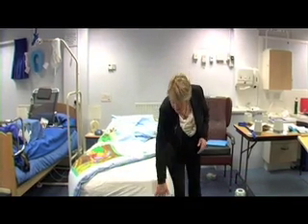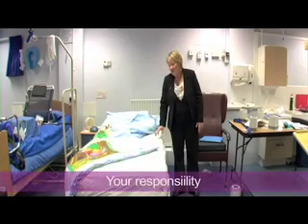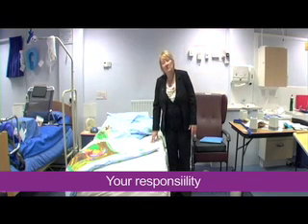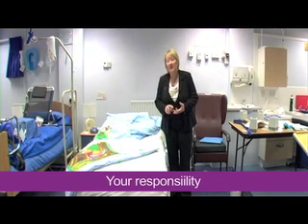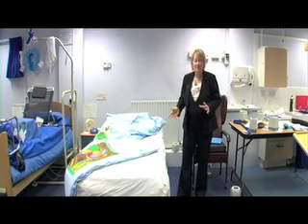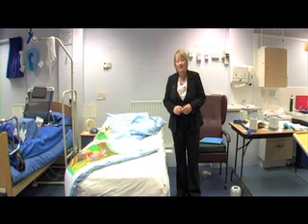You do need to, as I say, be very hands-on and make sure that you know what the bed is and what the mattress is like. So you really do need to know what your provision is. You can't rely on the Croydon community equipment stores fitting something and then taking responsibility for it. The responsibility is yours. If it's a slatted bed, you wouldn't normally put a bed stick on there. You'd need a rail for slatted beds. So do take a note of what type of bed it is. You do come across some old iron beds as well with springs and things. And again, the intake team will be able to help you in relation to that. But as long as you've noticed it, then that's the important thing.